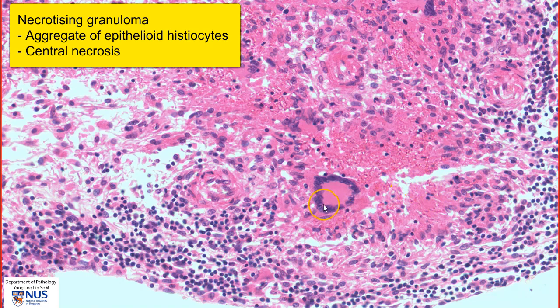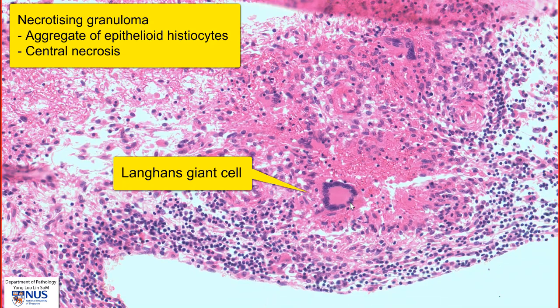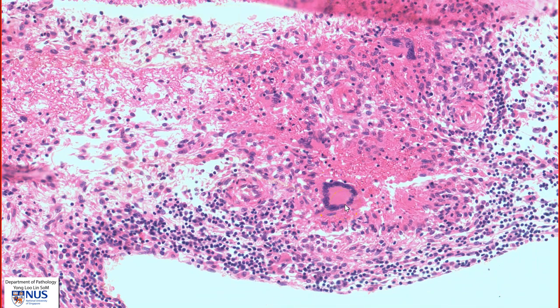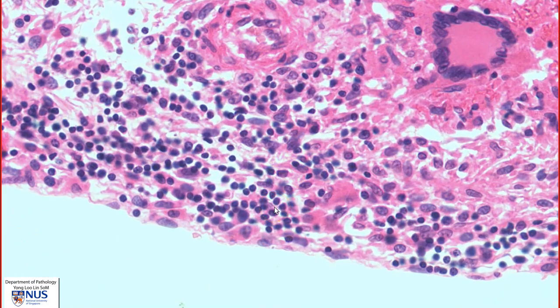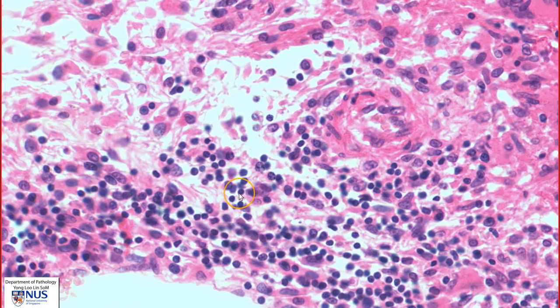We also have these scattered multinucleated giant cells, known as Langhans cells, as the nuclei are arranged in a horseshoe-shaped pattern. In this particular cell, the nuclei appear to be arranged in a ring, and this is because of the plane of sectioning. Around the granuloma, we can also see lots of chronic inflammatory cells, which are composed mostly of lymphocytes as well as some plasma cells.